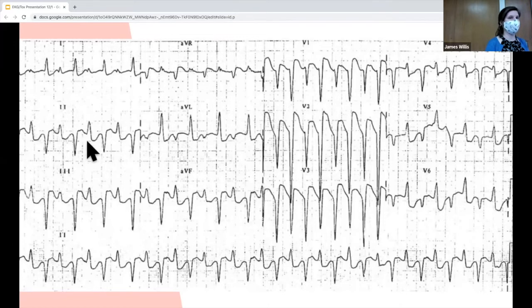I think about digoxin the same. There's something in every category that fits this, like syphilis does whatever it wants, digoxin does whatever it wants, hyperkalemia does whatever it wants. That's what digoxin does. So those two things are the hallmark, but you can just get any kind of supraventricular tachyarrhythmia. You can get, this here is called bidirectional VTAC, which I think is the coolest looking one. You can get frequent PVCs, sinus bradycardia, slow AFib, any type of AV block you want. Something called regularized A flutter, which is A flutter with a complete heart block, and then any type of VTAC.